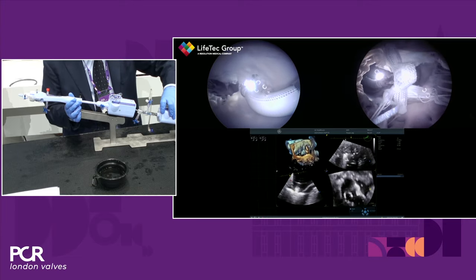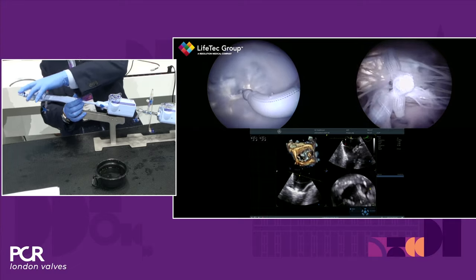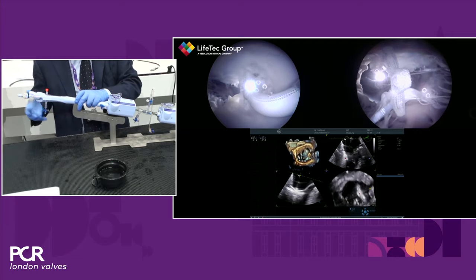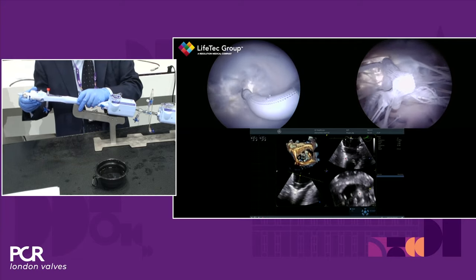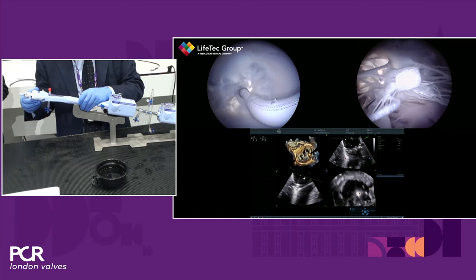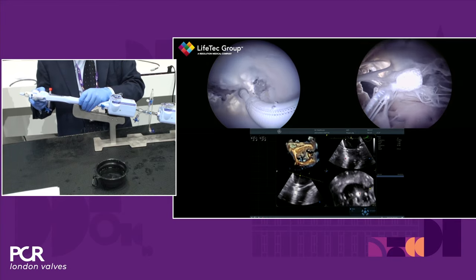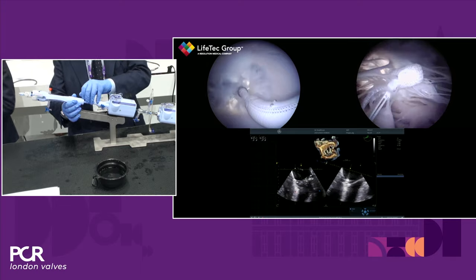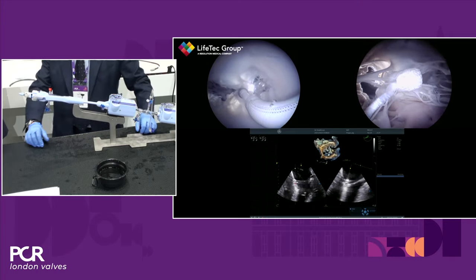Let's see. Now the leaflets are above the clip arms, and I think if you are happy with the leaflet insertion, you can actually grasp. So you drop your gripper, and then you close. While you close, it's extremely important to release the tension on the catheter, especially if there is a retracted posterior leaflet, like in this case, and a dilated annulus, because you can eventually damage the leaflet if you don't properly release the tension.